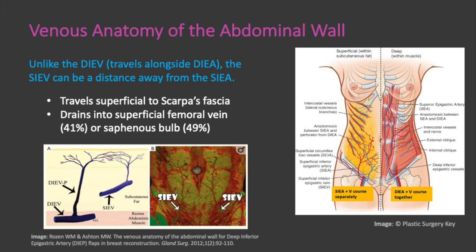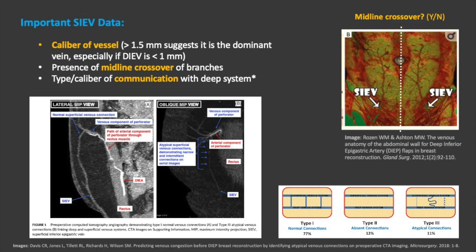Unlike the deep inferior epigastric vein, which travels alongside the DIEA, the superficial inferior epigastric vein can be a short distance away from the SIEA. This vein travels superficial to Scarpa's fascia and drains into the superficial femoral vein or the saphenous bulb. The caliber of venous perforators, the degree of midline crossover, and the caliber of the communicating vein between the perforating vein and the SIEV are important predictors of venous compromise. It can be helpful to identify the presence and caliber of this communication on CTA, as this information can aid in perforator selection.